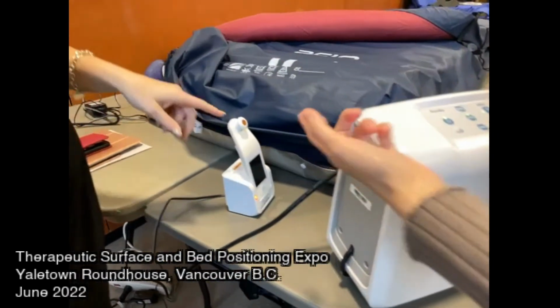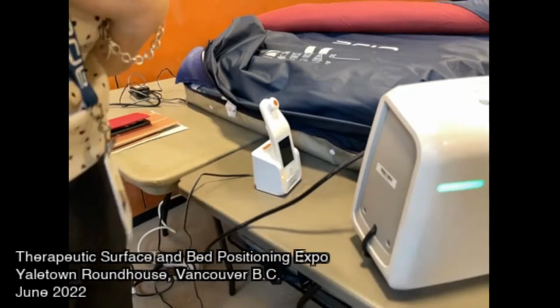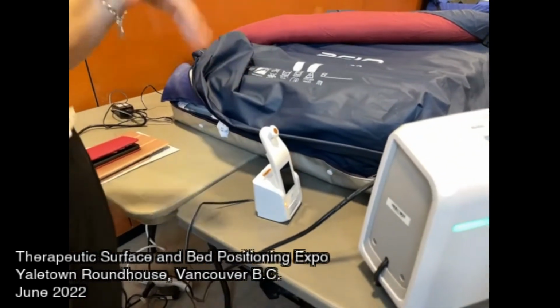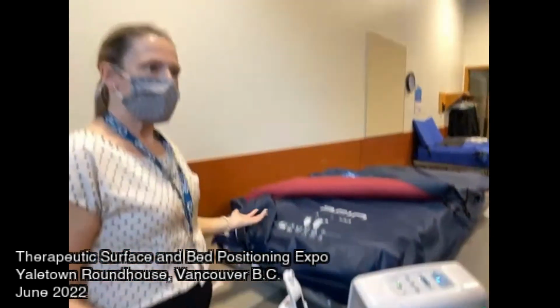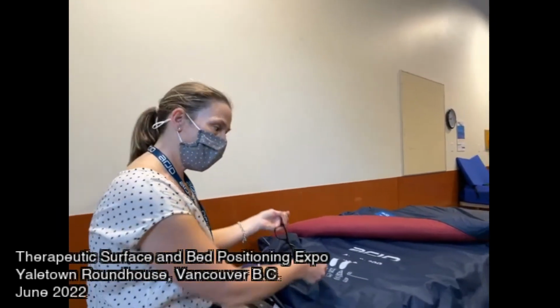Just hold the handle and then touch the skin. Sorry, can you say that again? So how do we use the machine? So in your mornings when you're getting up and getting dressed, if you're doing those sorts of daily routines, that would be a good time to go in and scan the heel.